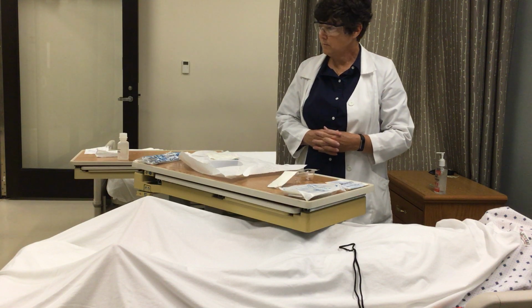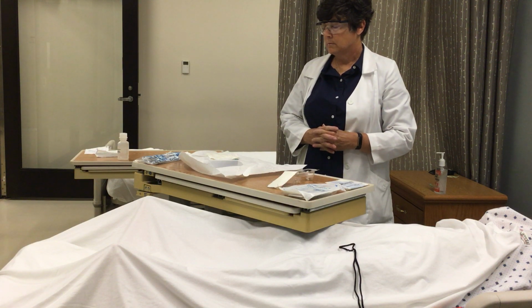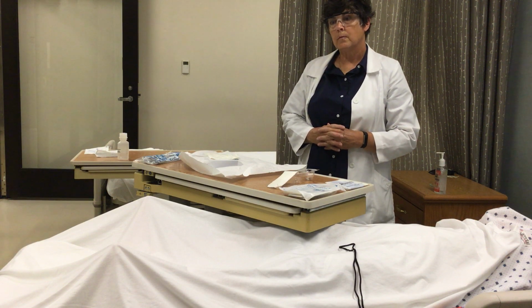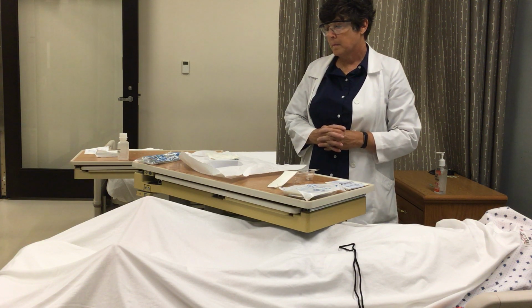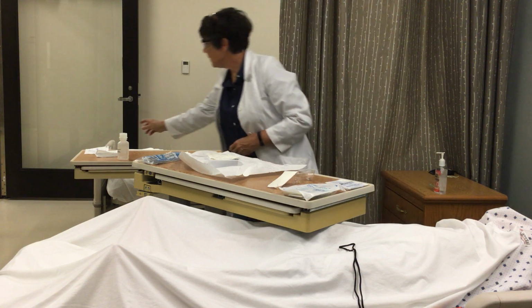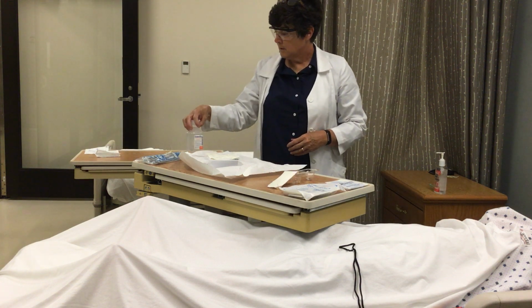Pour about 0.5 to 2 centimeters of normal saline into the sterile basin. Follow your facility's policy on the use of half-strength peroxide for cleaning tracheostomy inner cannulas. Okay, so I have my normal saline here.